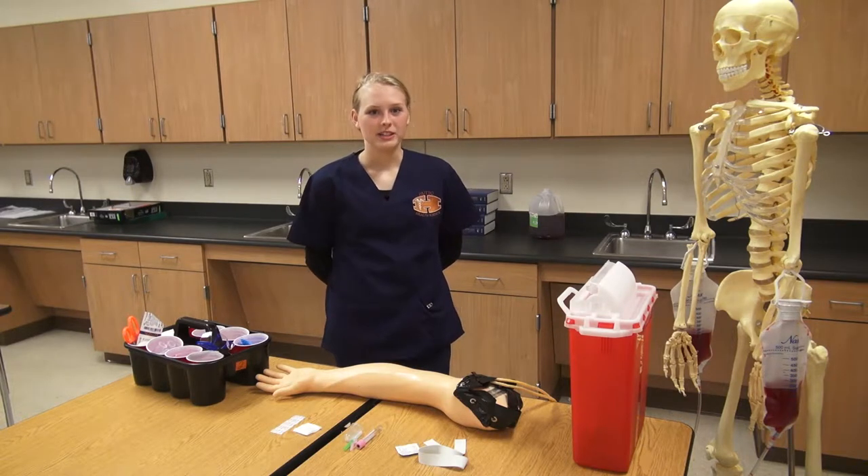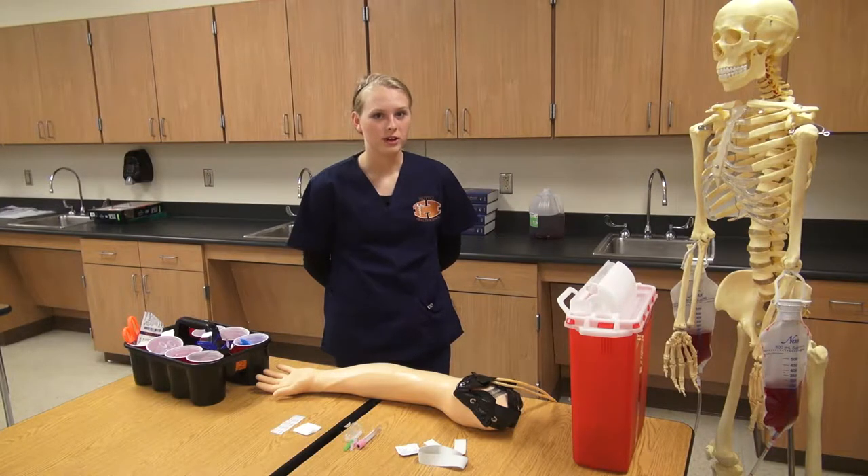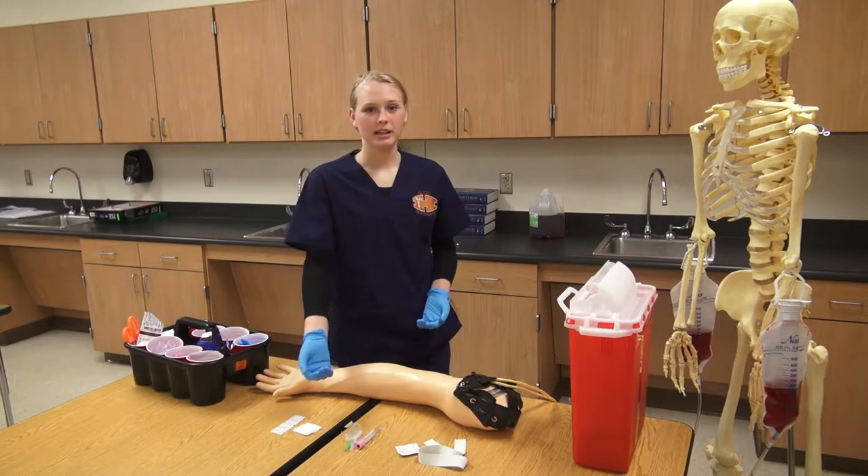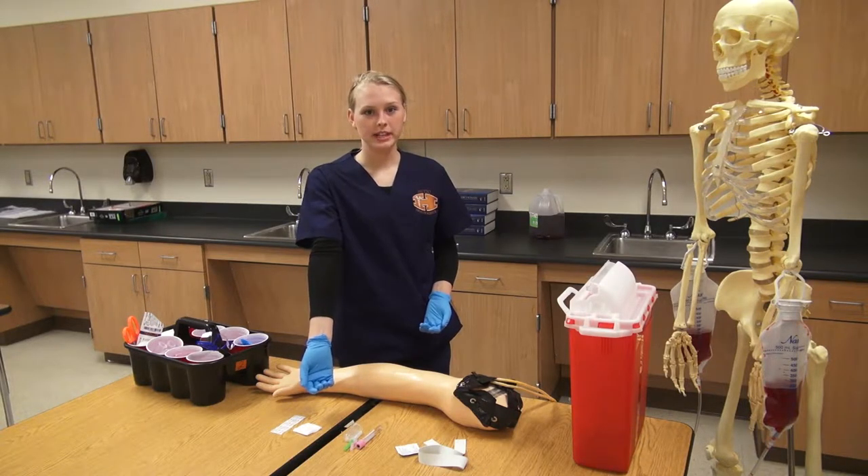After you have identified your patient, you'll want to ask if they have a preference of arms or if they have any medical reason that you cannot draw from one of their arms. Next, make sure that your patient's arm is in a supported position and that the inner elbow is exposed and straightened.